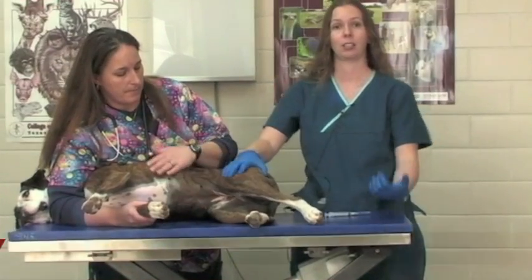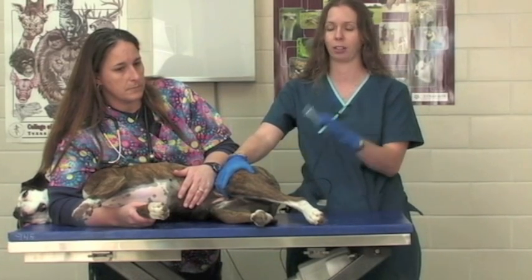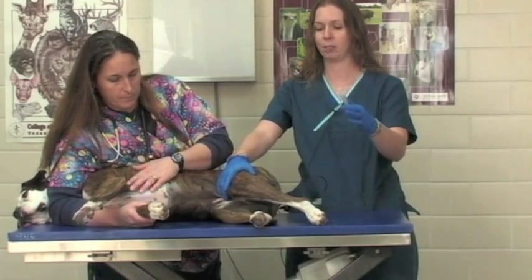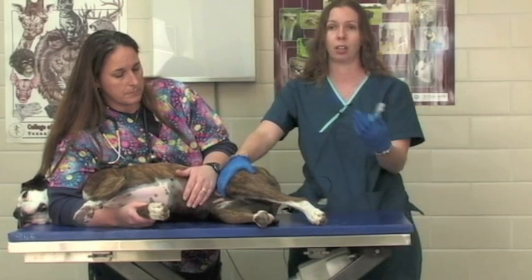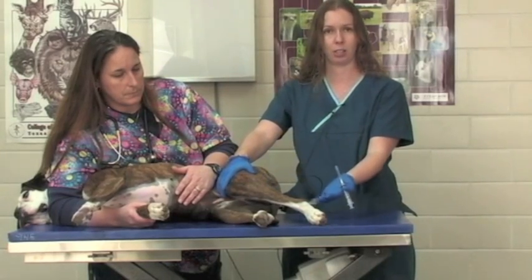We're going to talk about obtaining a cystocentesis from our patient. A cystocentesis is the method we use to obtain a urine sample directly from the patient's bladder. We can also obtain a urine sample by walking our patient outside and catching a free-catch sample. But if we need to obtain it directly from the patient's bladder, we can accomplish that by either placing a urinary catheter in our patient and then obtaining a urine sample that way.